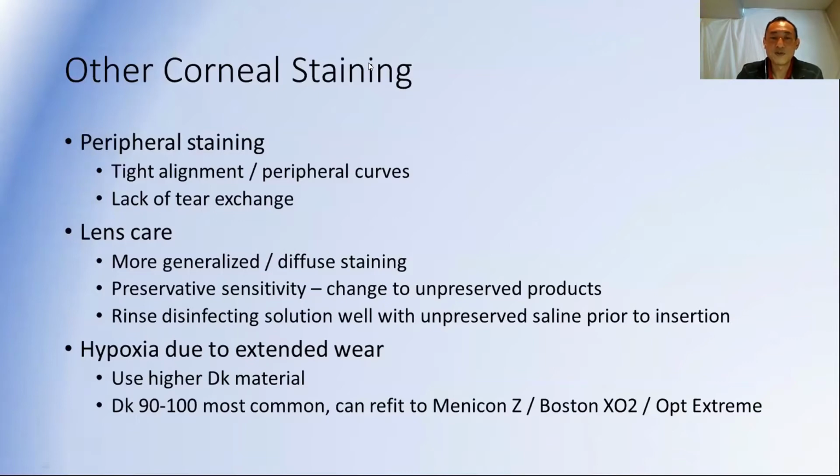What is your instrument to measure axial length? At the college, we use an IOL Master. I don't have one in my practice, but that's what we use at the college. What changes in the cornea due to Ortho-K affect the measurement? Well, the decrease in corneal thickness, the epithelial thickness may affect it a little bit, and also the flattening may affect it a little bit as well.